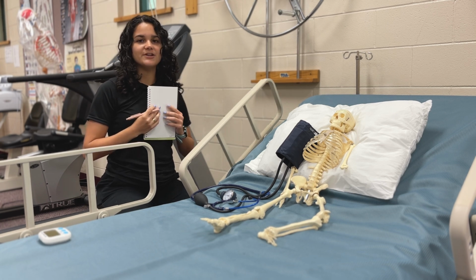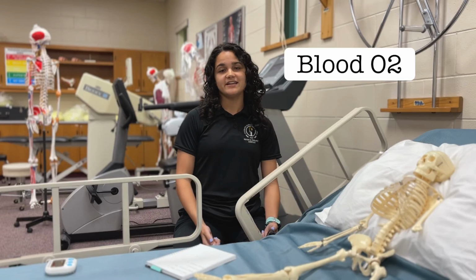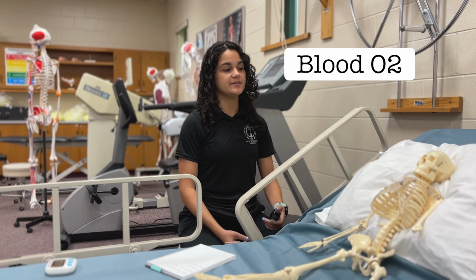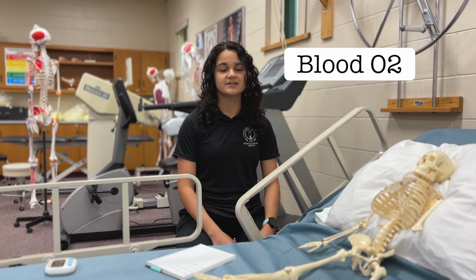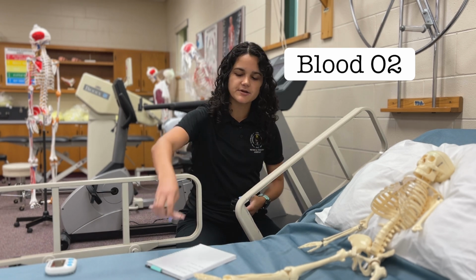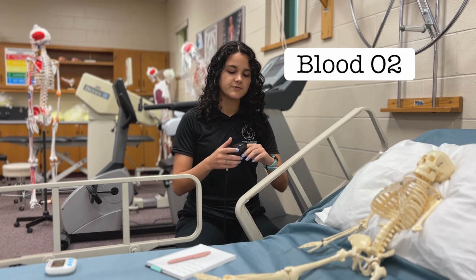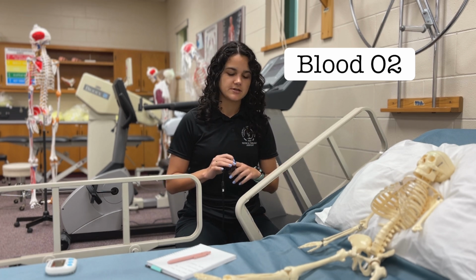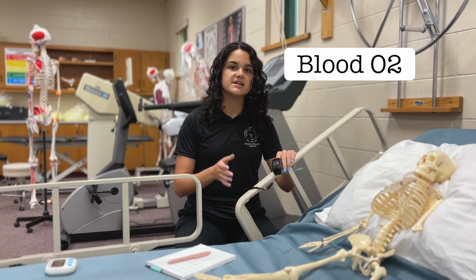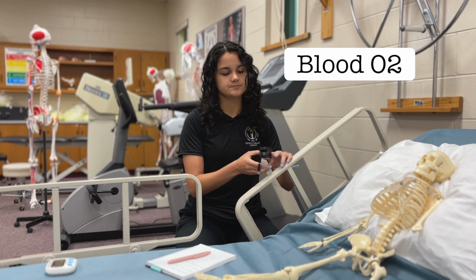Now on to blood oxygen saturation. Nowadays, measuring a patient's blood oxygen saturation might be the easiest vital that you can take because of this guy right here. This is called an oximeter. The way that it works is that for the patient, this is placed on their finger and it has certain sensors within it. When you press it on and you relax, it will give you the percentage of oxygen that is in your blood. And many of them also give heart rate.